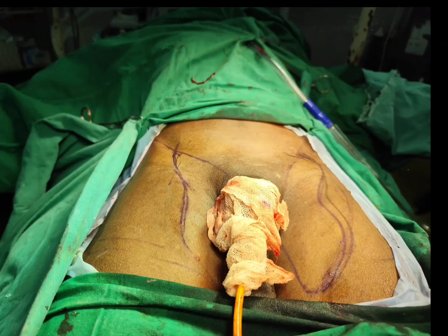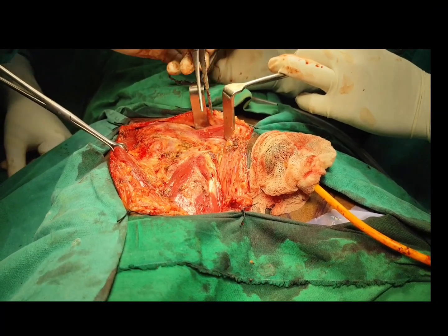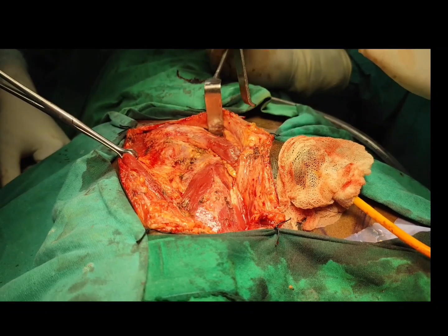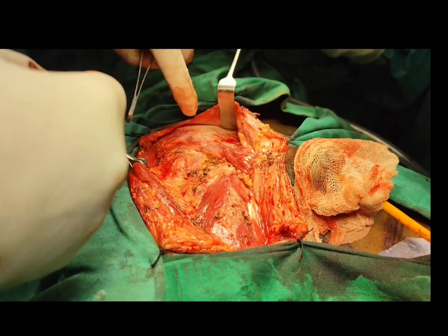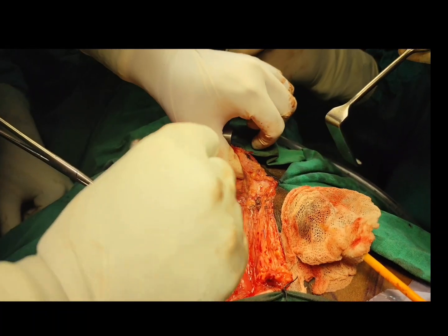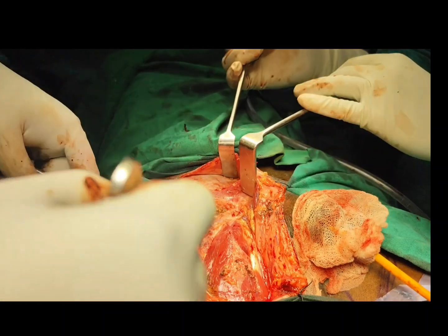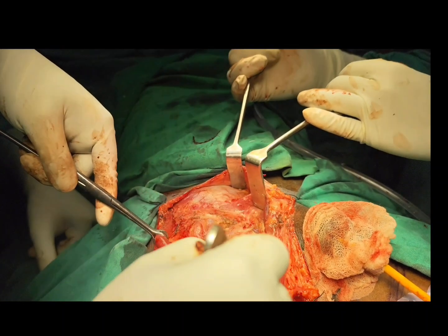Following that, we are doing a bilateral inguinal lymph node dissection, as this patient had superficial inguinal lymph nodes palpable. Here on the right side we have completed the inguinal lymph node dissection. Here we can see all the boundaries. Superiorly we can see the inguinal ligament here. We can see the spermatic cord superiorly, which is retracted now. All the superficial inguinal lymph nodes were cleared.